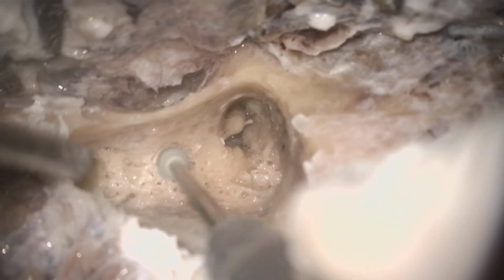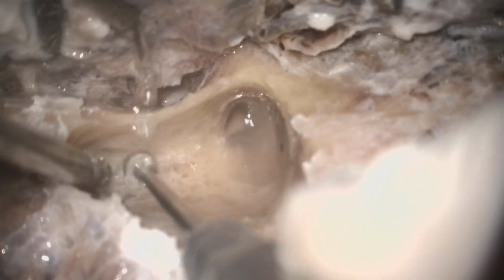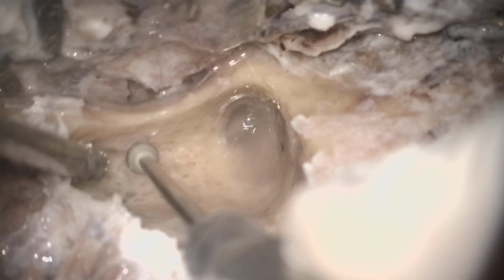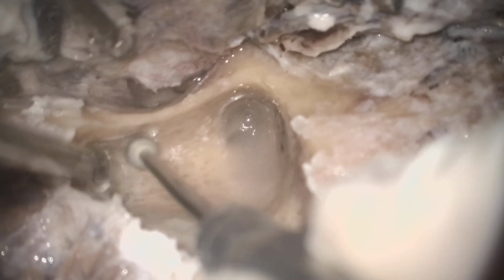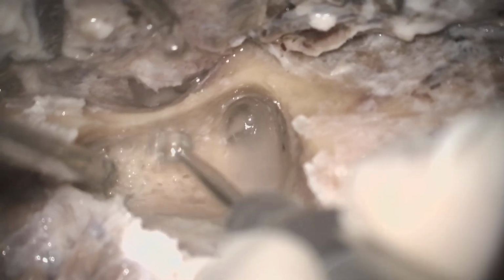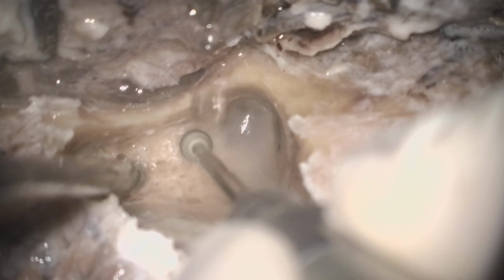Okay, now start drilling the posterior part. Water. So we have to delineate all the cells from the posterior part of the canal wall, so then we can visualize the ridge area. The ridge is a straight bony septum and is a thick bone. There will not be any cellular area over the ridge. So now these are the cells that we are delineating. Water. And we are going toward the posterior tympanotomy side.